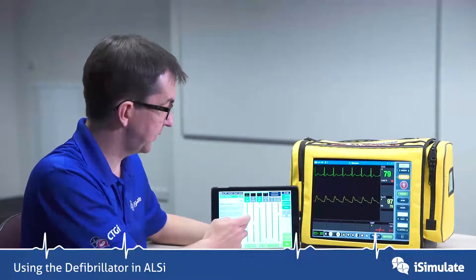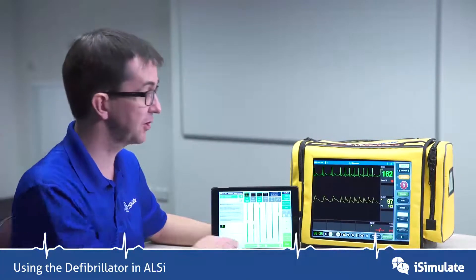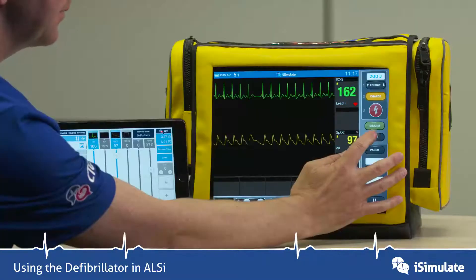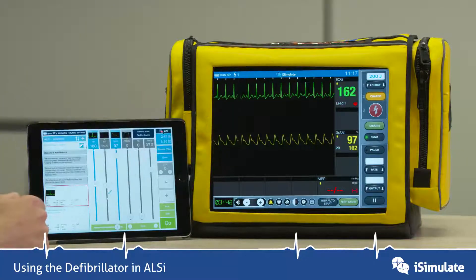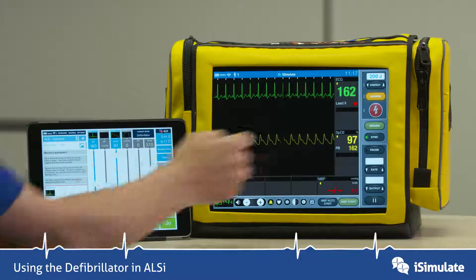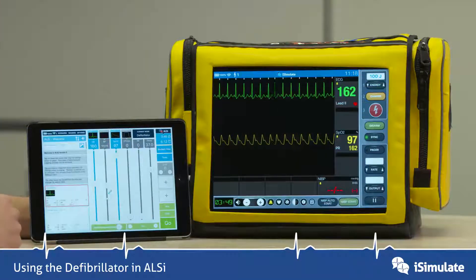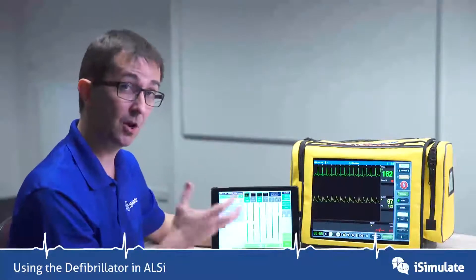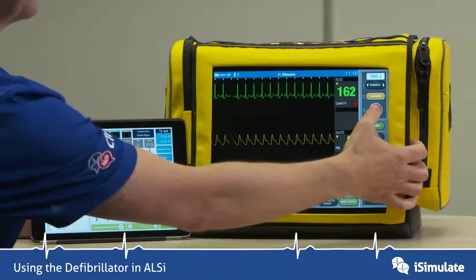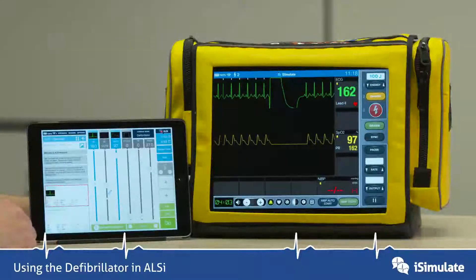Let's put the heart rate up, and we can now show the sync function. You can press sync, and you can see these little white markers appear to show where the shock is going to occur. We can reduce the energy down, press charge, and to administer a synchronized shock, we need to press and hold the shock button. And the shock is delivered.